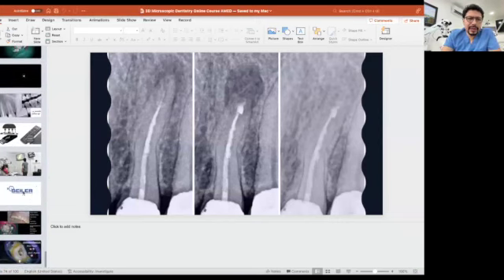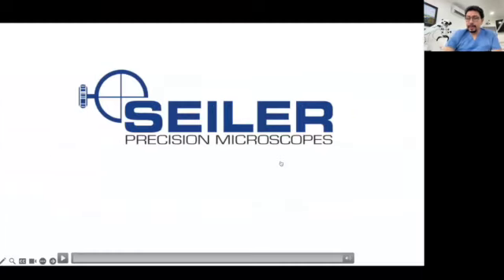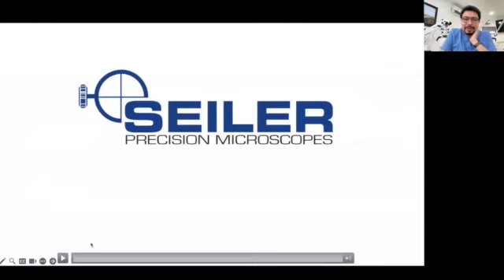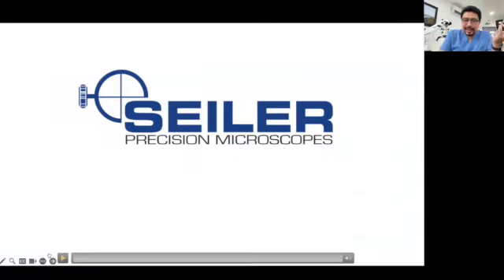Let's go for some clinical tips. I will play a video for you. You can see this video in the social media of Seiler as well, but I want to explain to you guys some specific parts of this video, because this video has some useful clinical tips.